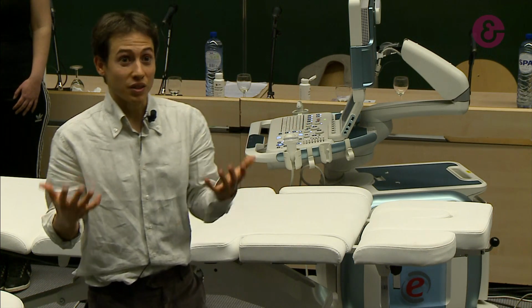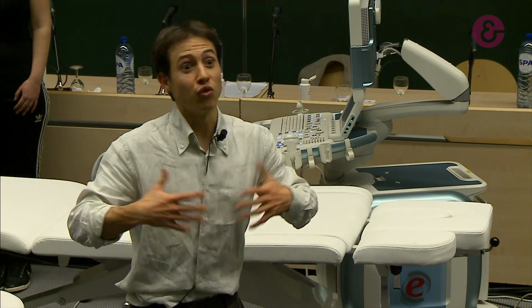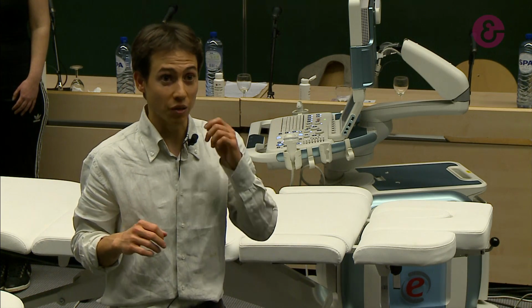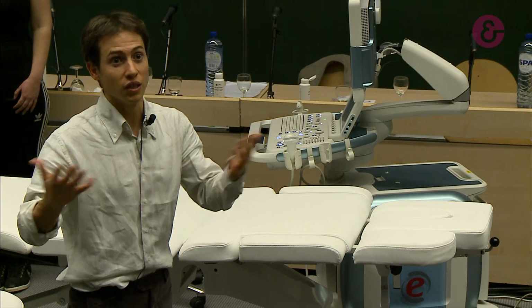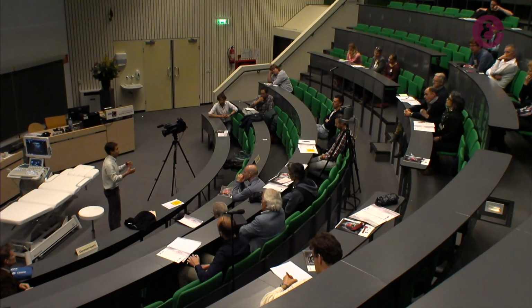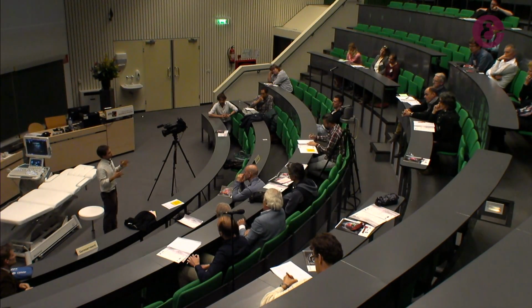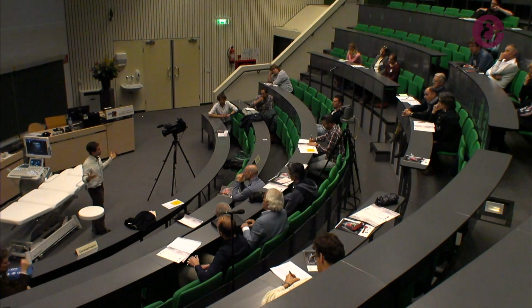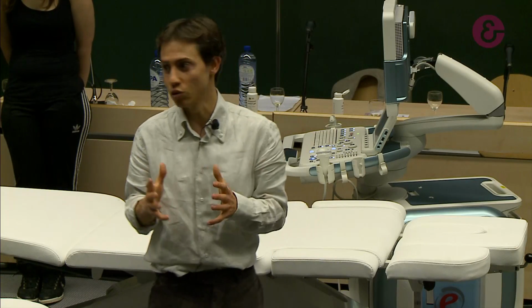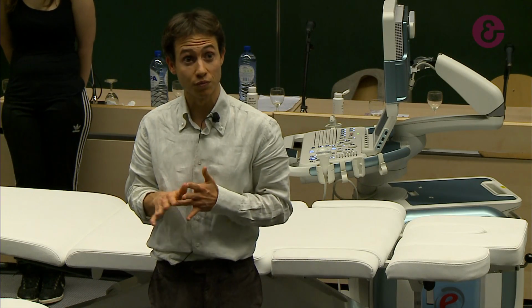If I can, because this depends a little bit on the morphology of your patient. Sometimes here it's very easy to see images with the ultrasound, but normal life could be a little bit more challenging. Normally I work with athletes, so it's easier, but with more sedentary people it could be a little bit more difficult.